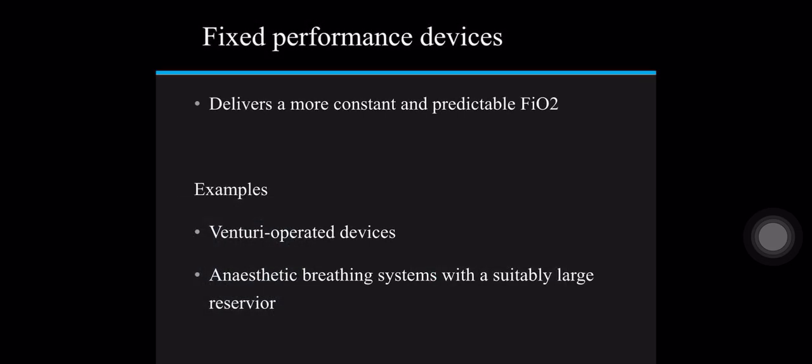Okay, fixed performance devices deliver a more constant and predictable fractional inspired oxygen concentration. Examples are the Venturi operated devices or anesthetic breathing systems with a suitably large reservoir.